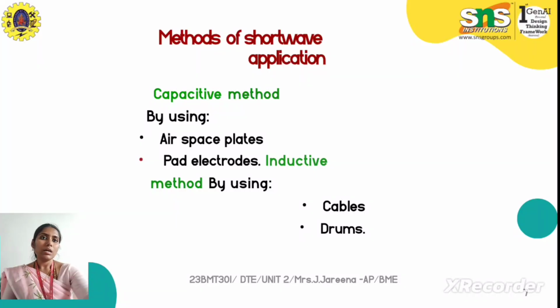Next class we will discuss the different methods of shortwave application. That is two methods: the capacitive method and the inductive method.